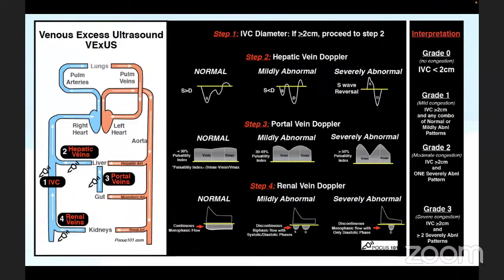Hello, Dinesh, nice presentation. Thank you. Suppose you are unable to visualize the IVC, suppose in a post-operative case, post-operative upper abdominal surgeries, like any thoraco-abdominal surgeries, what is your approach?